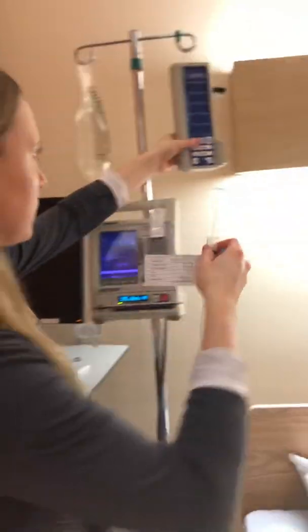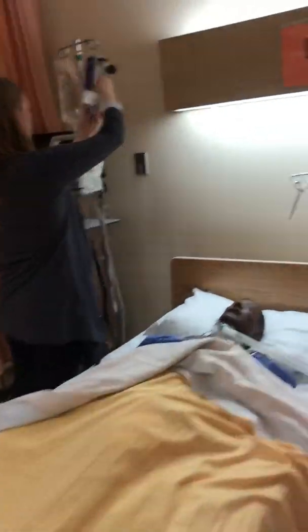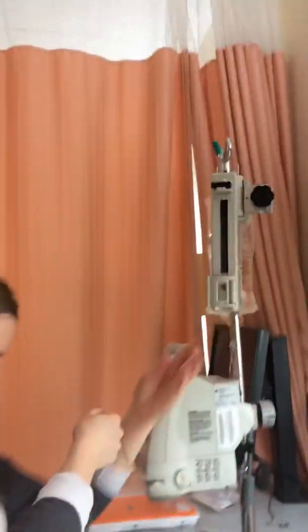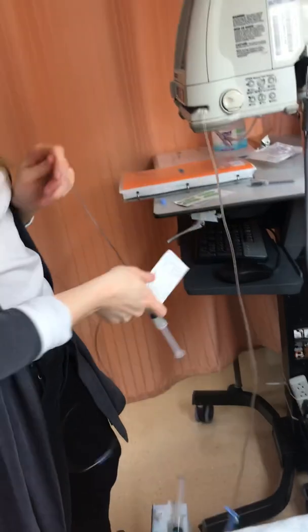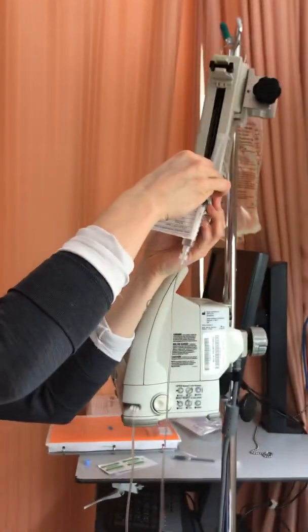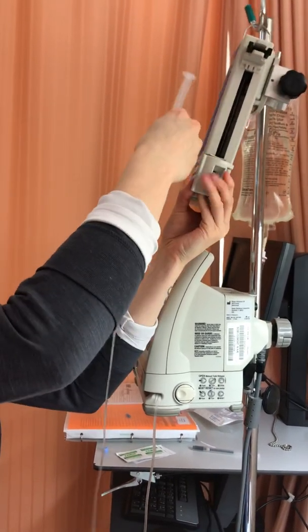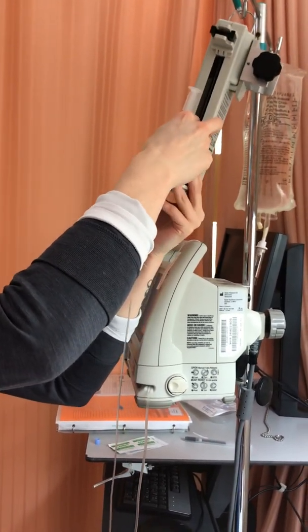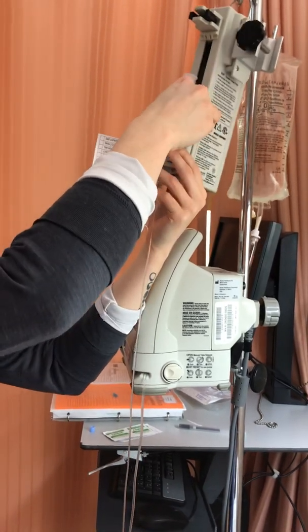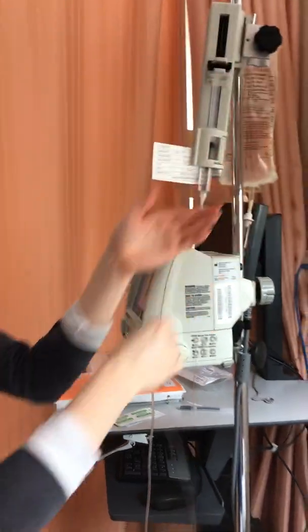At this point, I would grab my CIVA machine. Drop this, grab the CIVA machine, open it up, put that down.